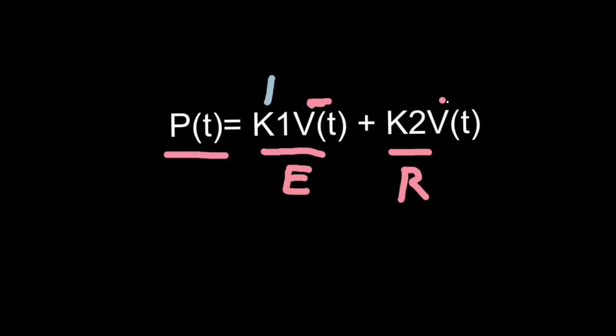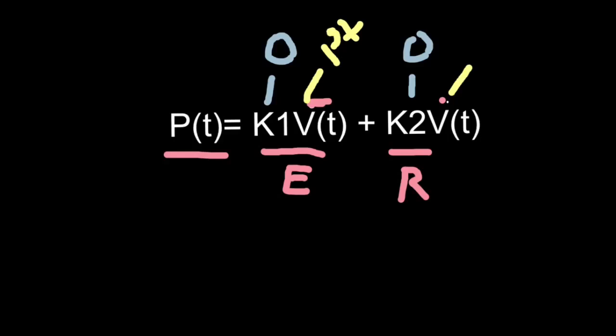Values K1 and K2 are actually operator set. The operator sets them on the ventilator, or the ventilator sets them behind the scenes in the background. And my volume, V, and this V with the dot, flow, these are generated by the patient's inspiratory effort. So I'm just going to put patient here. And this slide's getting a little too messy, but I'll further explain it in slides to follow.